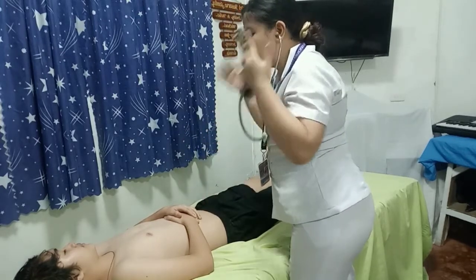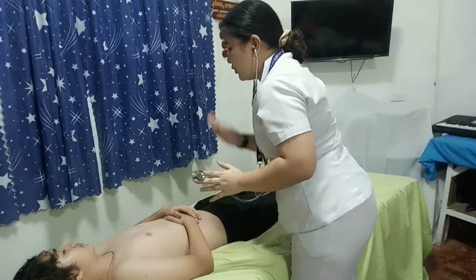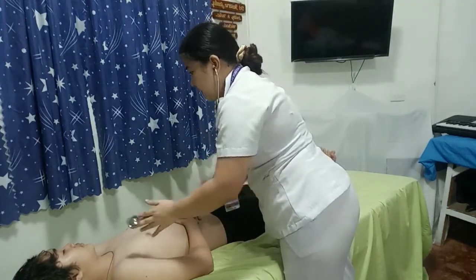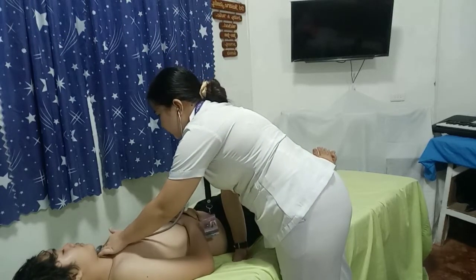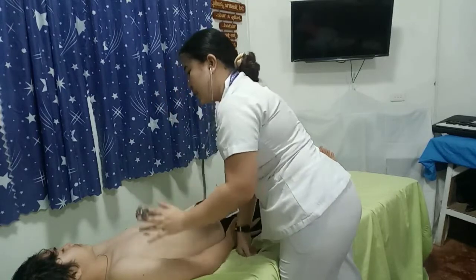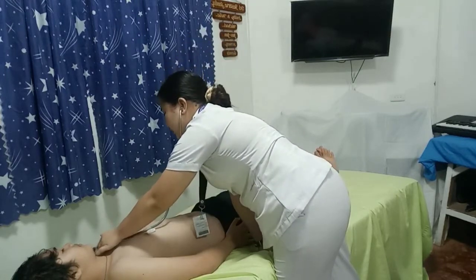Okay. So I am going to start above the clavicles down to the base of your lungs at the sixth rib. What I want you to do is to exhale and inhale deeply, okay? This is to avoid transmission of sounds that may occur during nasal breathing. Okay, so let's start.